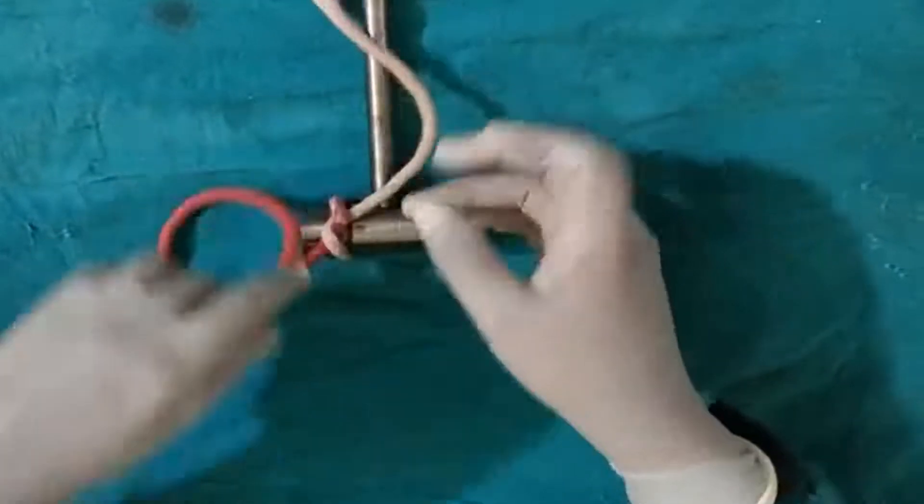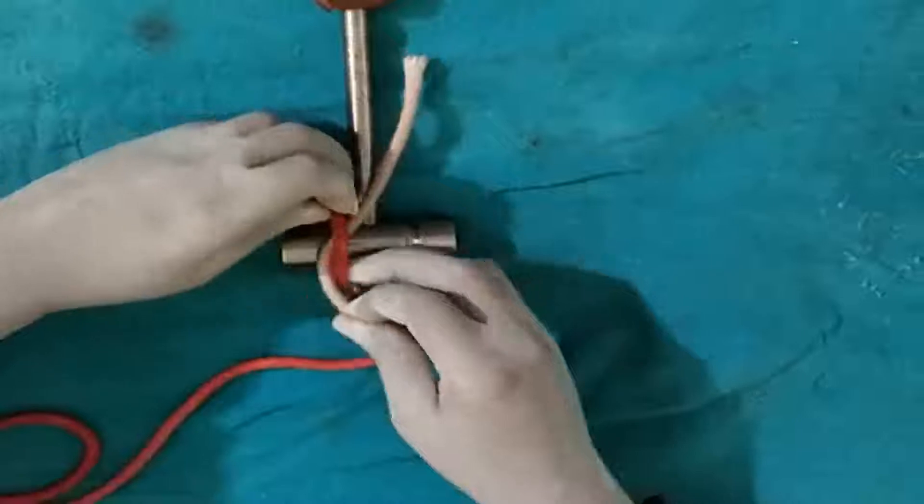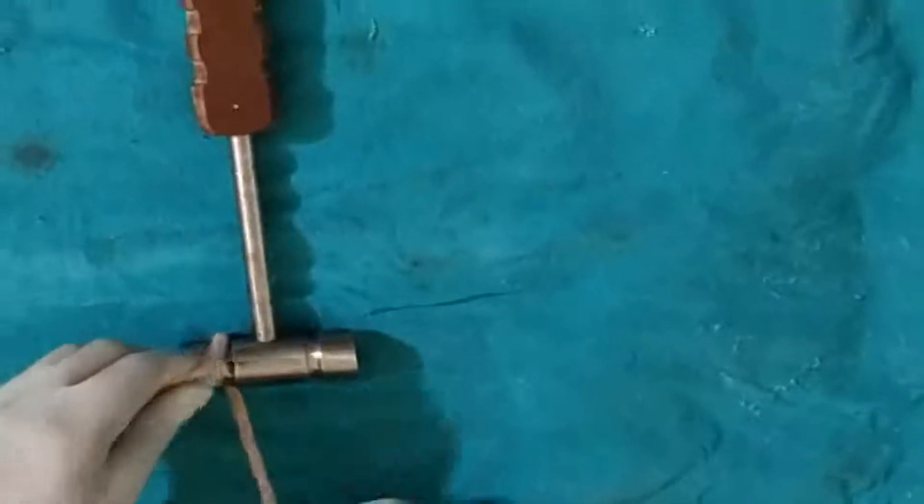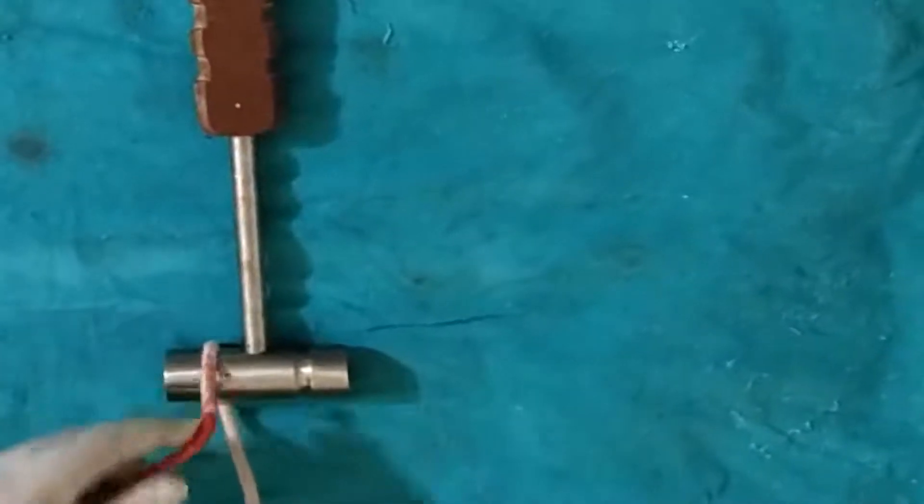The one-hand tie is very useful where the space is less or where you cannot reach with the instrument. Definitely the one-hand tie is very useful in those situations.